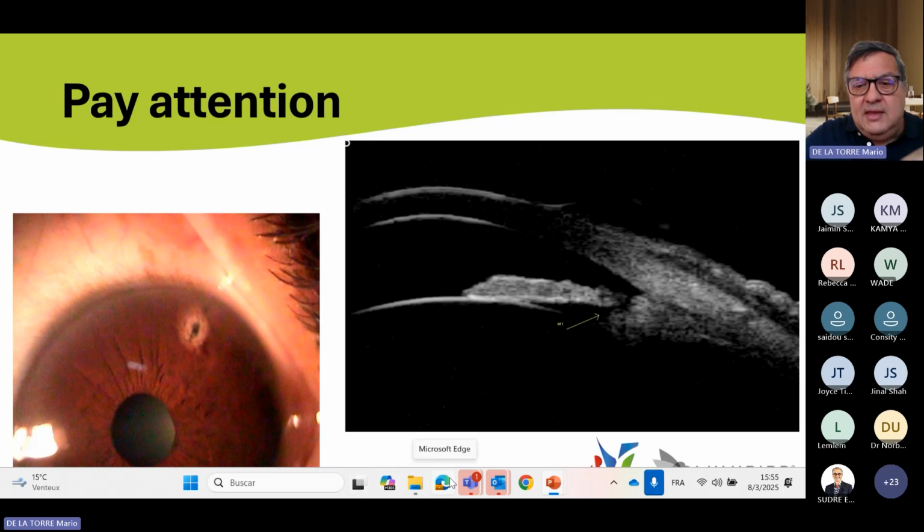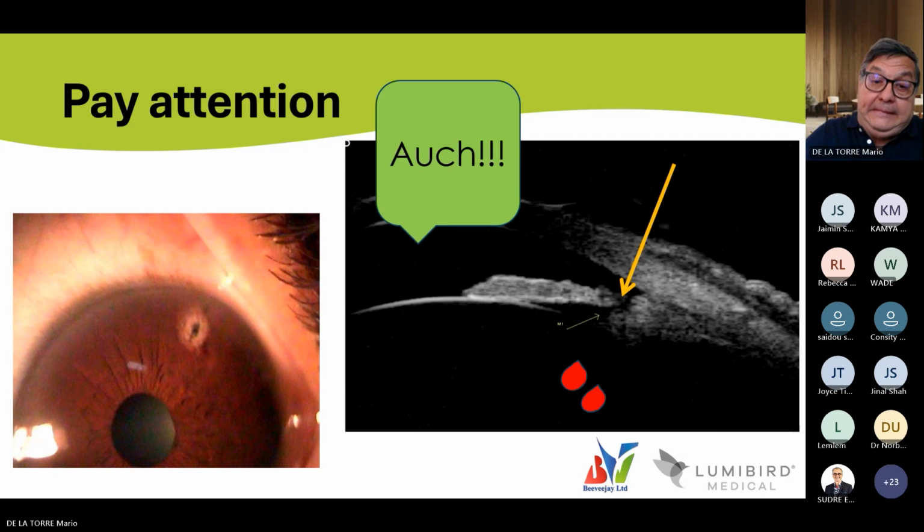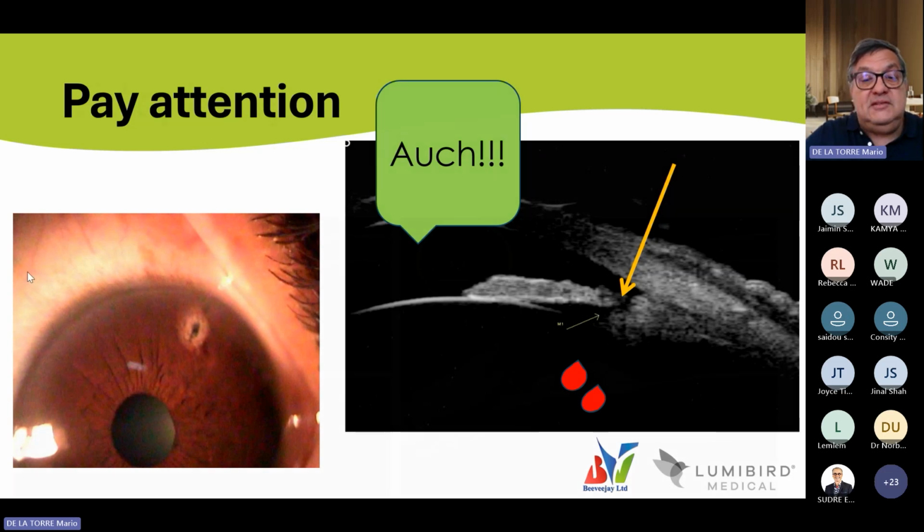No, pay attention. He knew that the ciliary body was very anterior, and doing an iridotomy very near the angle can cause damage, bleeding and also pain. Sometimes it's not because the doctor doesn't know well. He is clever, he has a UBM and makes the diagnostic process.